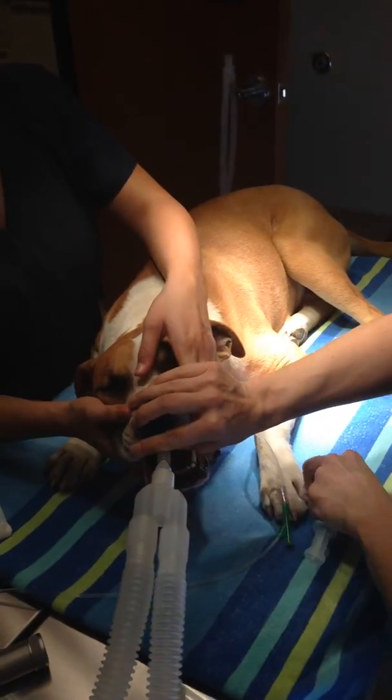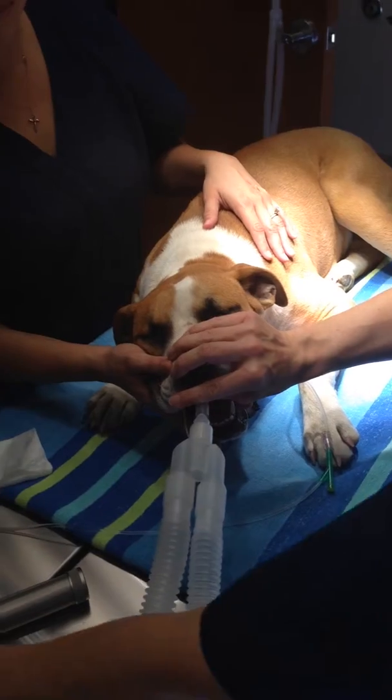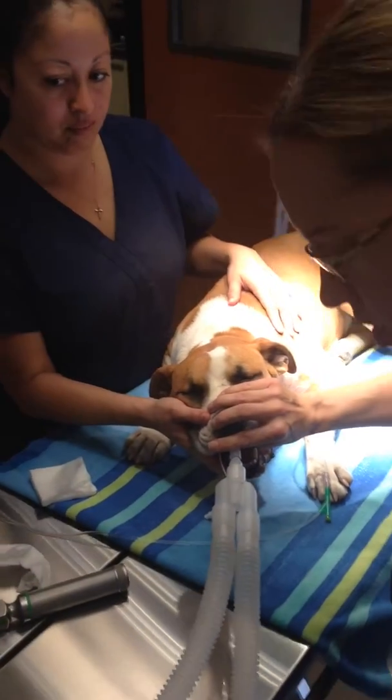We're done with the propofol, we're gonna remove this. He's getting just a flow of oxygen at the moment, so we're gonna turn on the anesthesia — we'll start at one and a half.